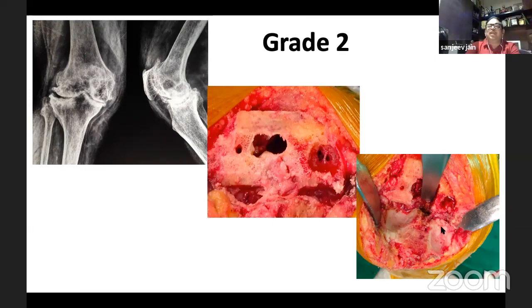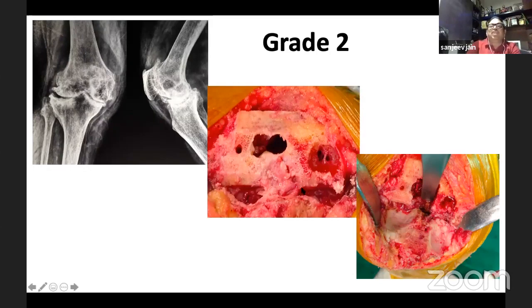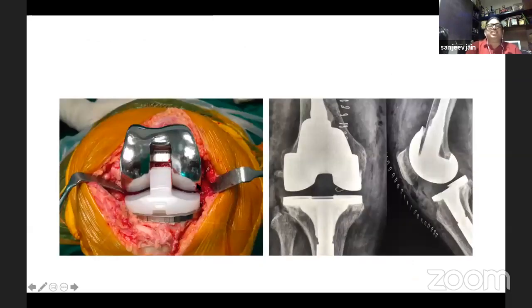a simple constrained implant to balance the knee. And in this situation, you also have to be careful in deciding about the rotation, which Ronan has talked about. When you're using this kind of implant, you can always decide about the rotation with a cast, or as Ronan has described, how to take care of the hypoplastic lateral femoral condyle and the femoral component rotation. Even Rajesh was talking about it. You can judge and place your implant. So always, these constrained implants, when there are bone defects, have to be supplemented by a stem on both sides.